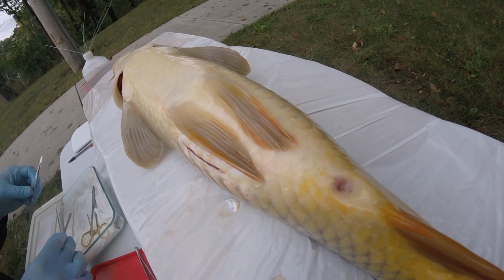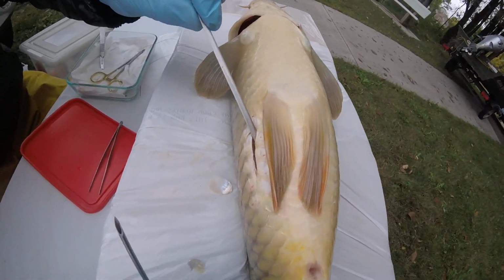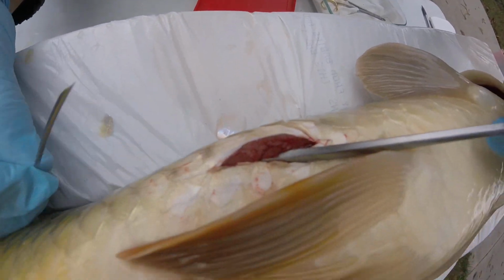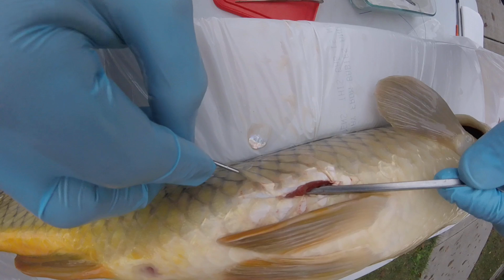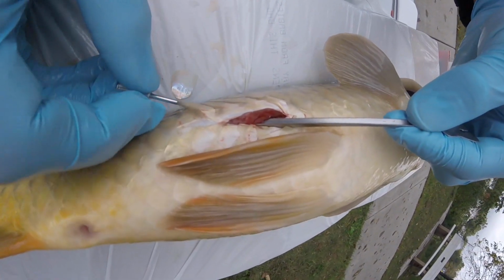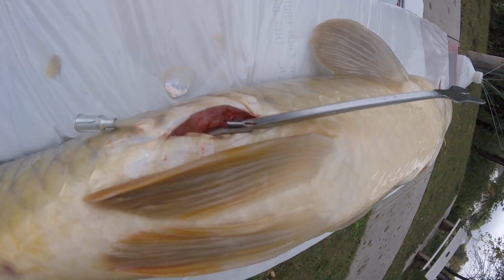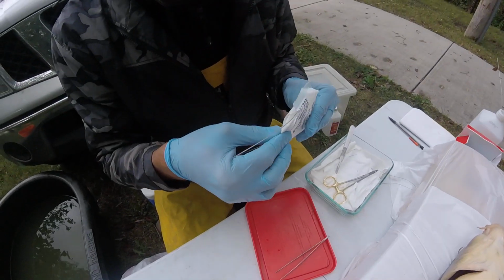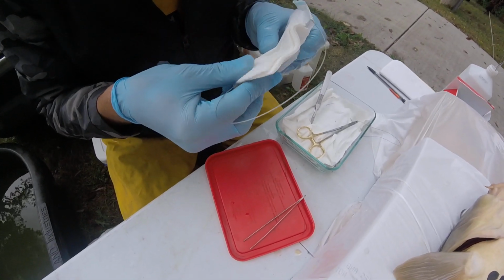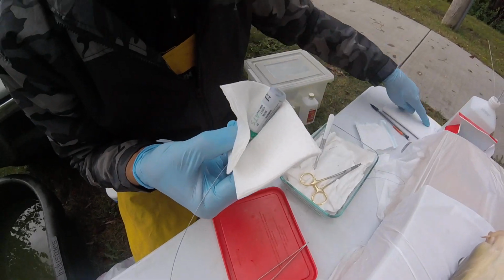Cool. And then the next step is to put the guide in, and this will be how the antenna will stick out the side of the fish. So this is just a heavy gauge hypodermic. Okay. Go under a scale, and then that's going through the body wall, and the guide is preventing me again from puncturing into the fish. And then we kind of set it like that. And then I'm going to triple check that I have the tag number correct. This tag is sterile. It's in sterile gauze. It's been sterilized in isopropyl. 48151. We've got it.